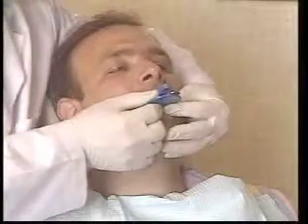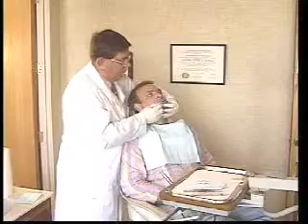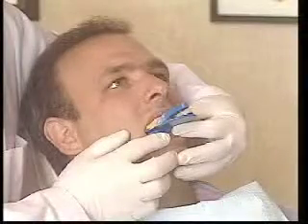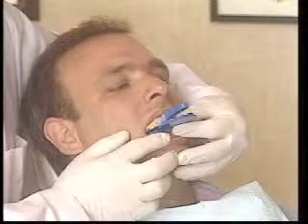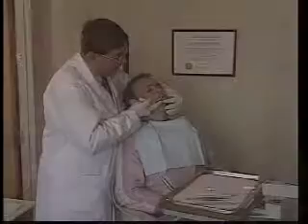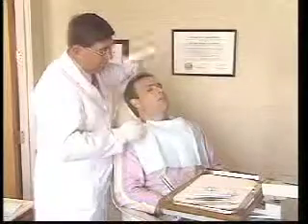Move the putty material around the edges of the clutches to obtain a good fit. Hold the clutches to maintain them in the midline position until the putty achieves initial set. It is important to do this because the occlusal plane is not necessarily level, which can result in the tracing area deflecting to one side. Okay, open, Randy, please. From this point on, the separating plate will no longer be needed.